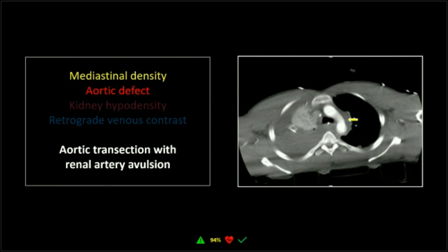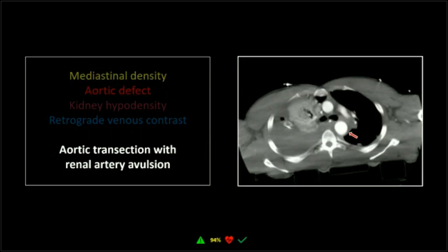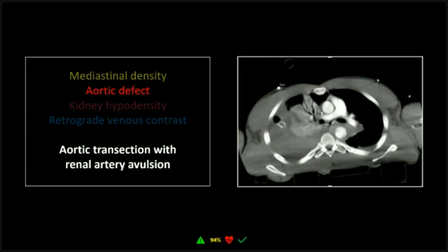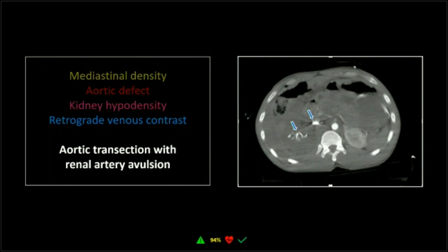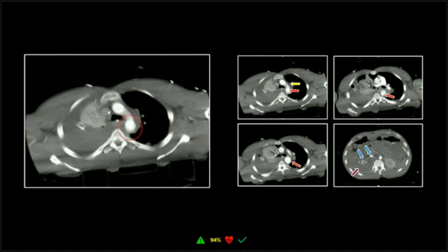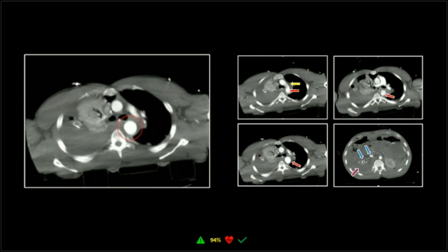This one is an aortic transection. We've got mediastinal density at the proximal aspect of the tear, then an intervening segment of dilated aorta — not really aorta, but a pseudoaneurysm bound by adventitia — and then the distal aspect of the tear. This is a complete transection where the aorta has pulled apart but the adventitia remains intact. Down in the abdomen the nephrograms are markedly asymmetric, which should definitely catch your eye.